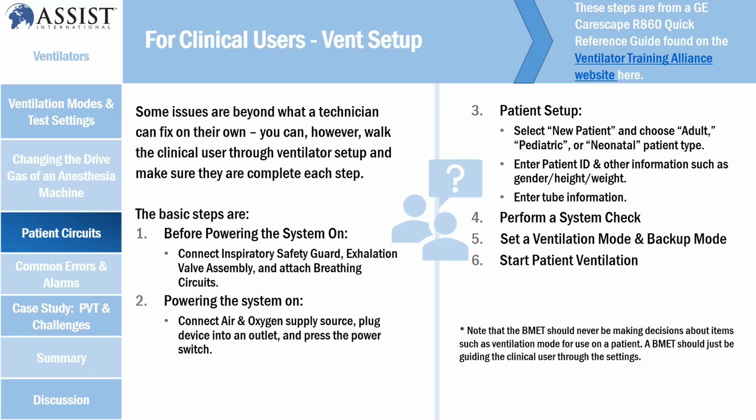Okay, for the clinical user, this is very important. This should be a daily routine that the clinical user has to do early morning before they use it on the patient. Okay, this is based on the steps from the GE Carescape R860 quick reference guide.